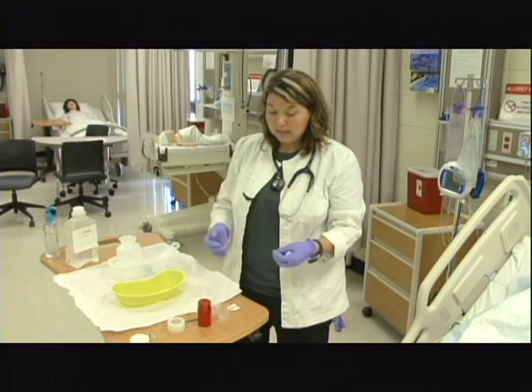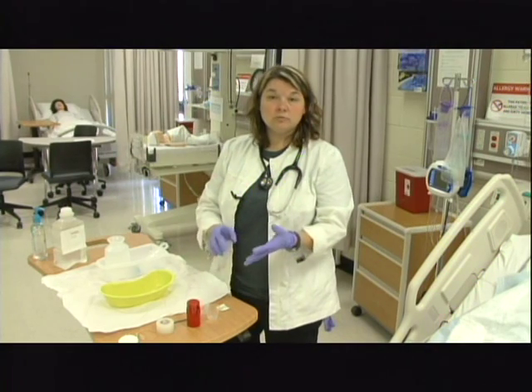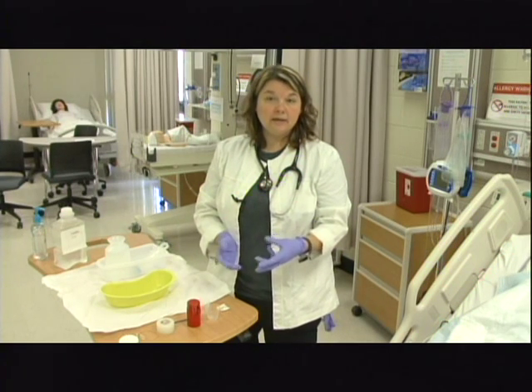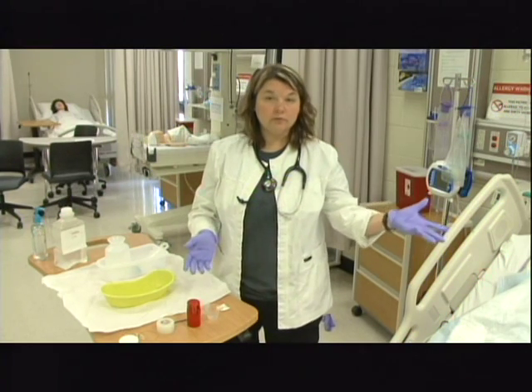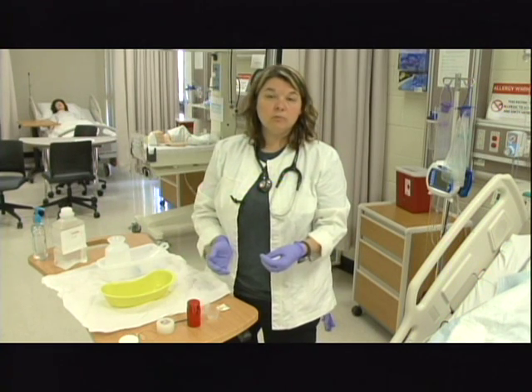Whenever you give tube medications, if they're going down the tube, obviously you need to make sure that you've confirmed the 6 rights, and you can't change the route that the medicine is ordered by. You have to have the doctor change that. But you can crush the pills, because obviously I'm not going to put the whole pill down the tube like this, or it would occlude or wouldn't fit through, as long as the pills are able to be crushed.